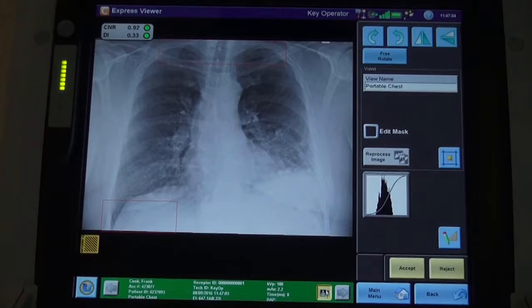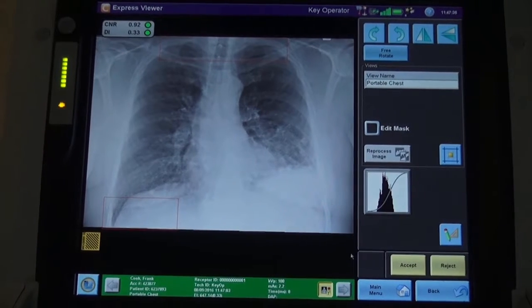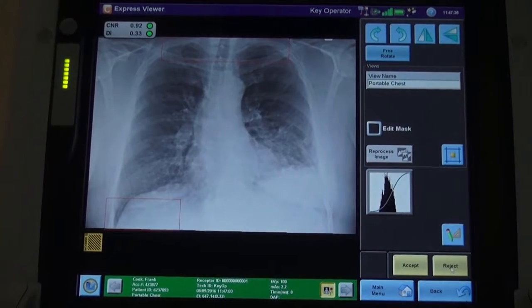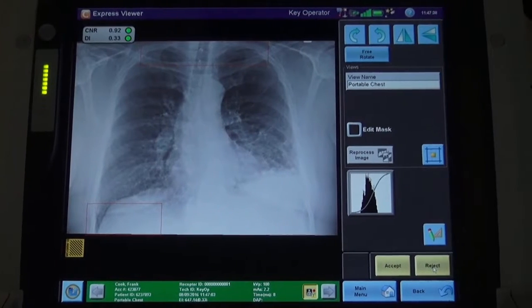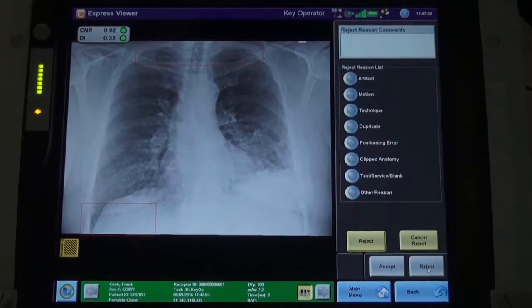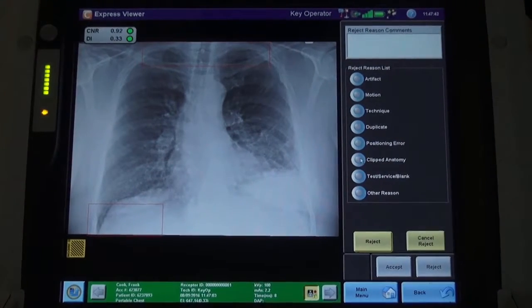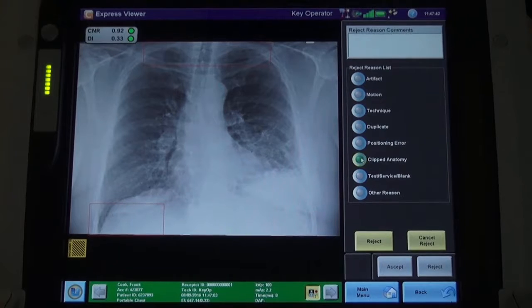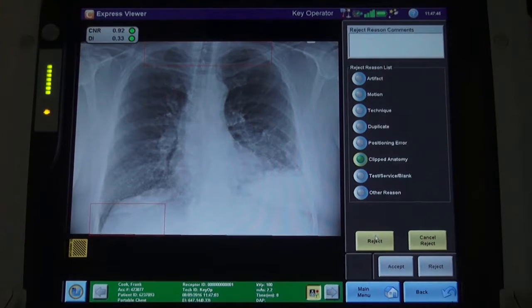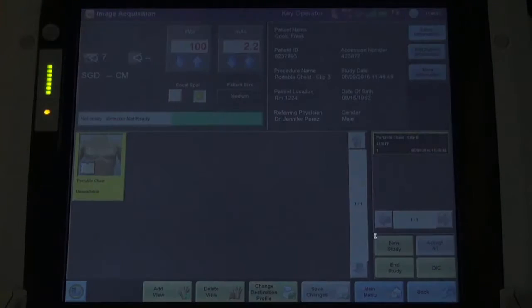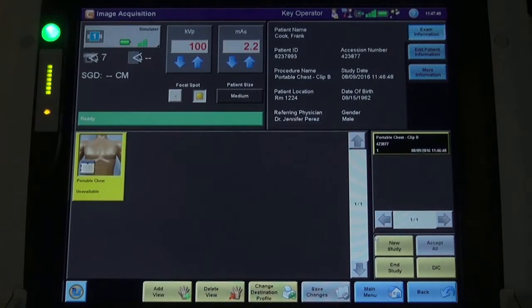Non-grid images will have less contrast. As contrast decreases, the CNR value decreases and the display will show as red to the user to indicate that action should be taken, such as using a grid or adjusting the mAs. The radiographer can then choose to accept the image as is, or reject the image and adjust accordingly.